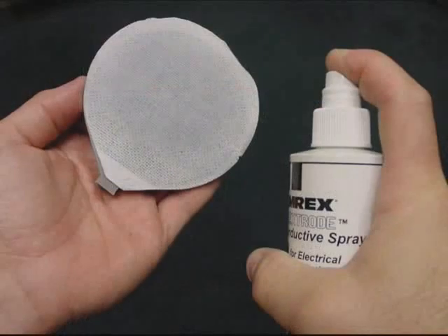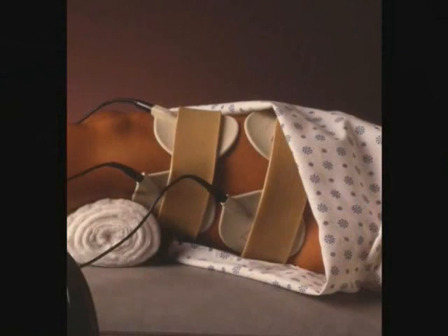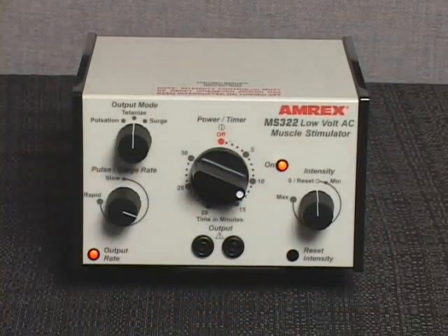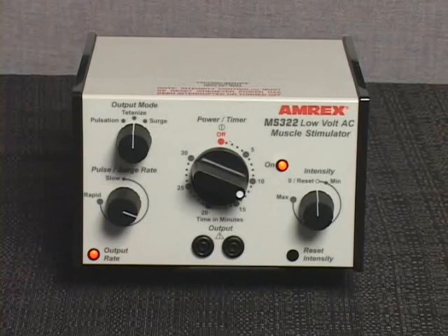Prepare the pad electrodes and apply them to the patient. They may be held in place using retention straps or weight bags. Rotate the power timer knob and set it to the desired treatment duration. The stimulator on indicator light will illuminate.